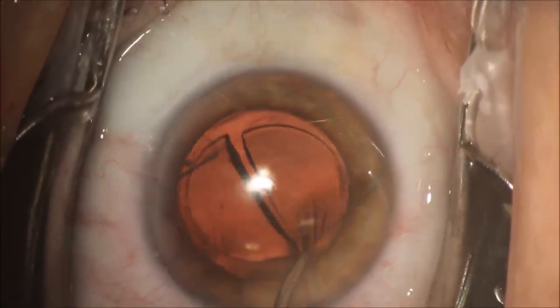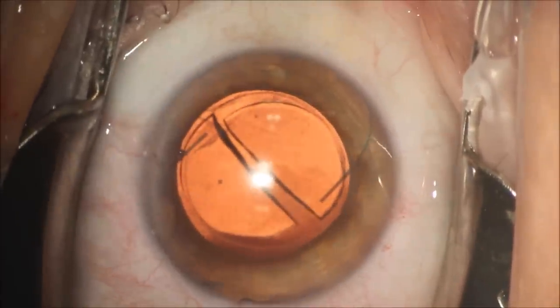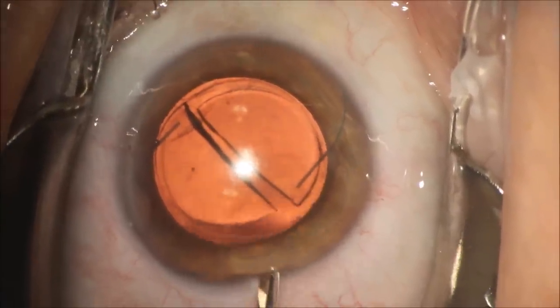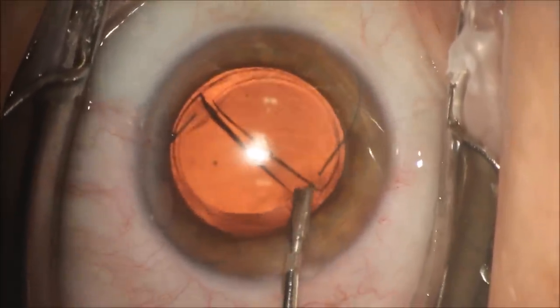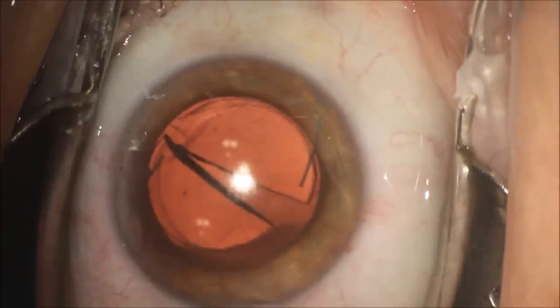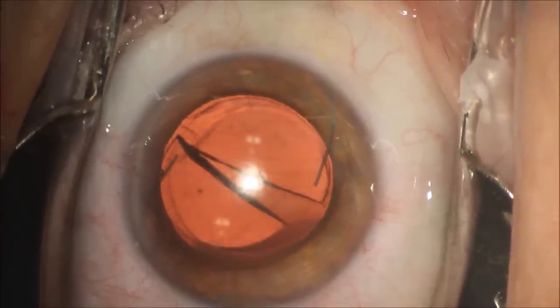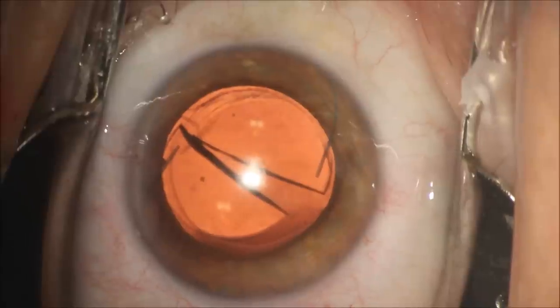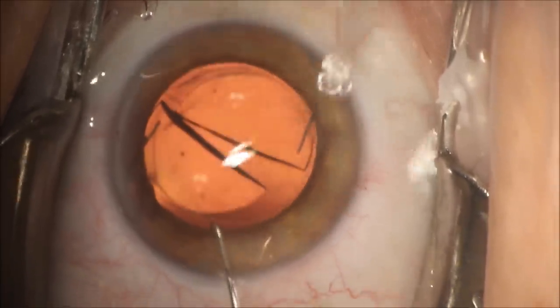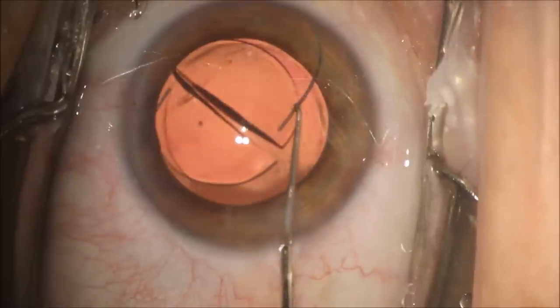had been made previously. We inject a viscoelastic again underneath the intraocular lens to protect the capsular bag and corneal endothelium, and position the lens halves in a way where they will be easily maneuvered out of the eye. You always want the haptic so that it will fold in when you pull the lens half out of the eye. You don't want it to act like a barb or a fish hook and get stuck in the eye when removing the lens half.